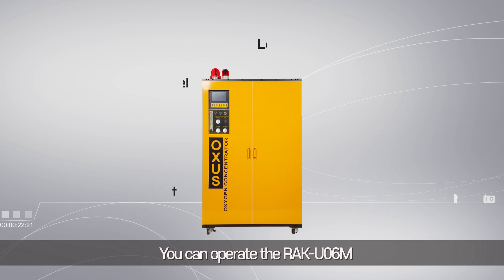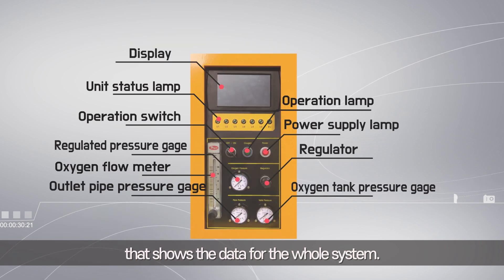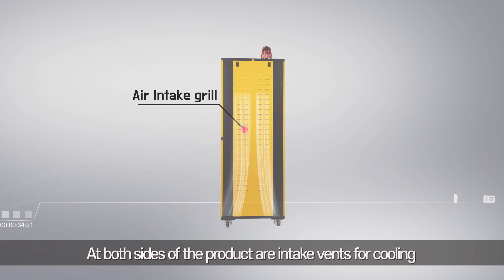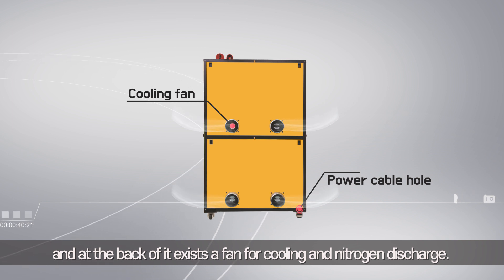You can operate the RAK UO6M through the control panel located on the top left of the product front, which shows data for the whole system. At both sides of the product are intake vents for cooling, and at the back exists a fan for cooling and nitrogen discharge.